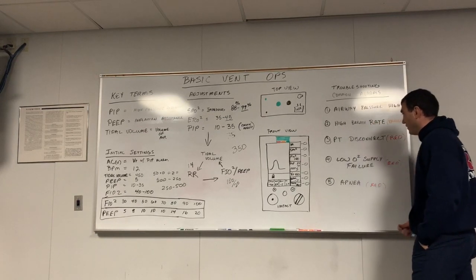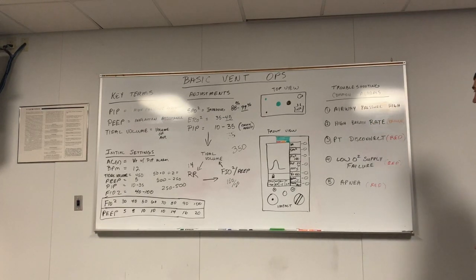Okay, so I've gone through these and came up with the most common ones that I see or get questions about, and how to correct them. Okay? So the most common alarm that you generally see on calls, in my own personal experience, is airway pressure high. Okay, that's your number one alarm.